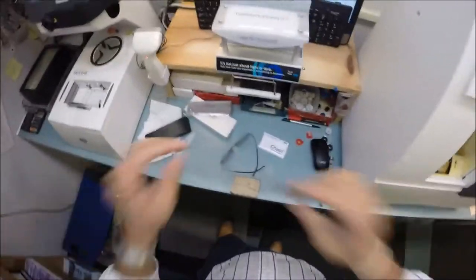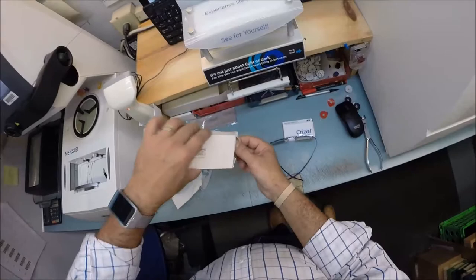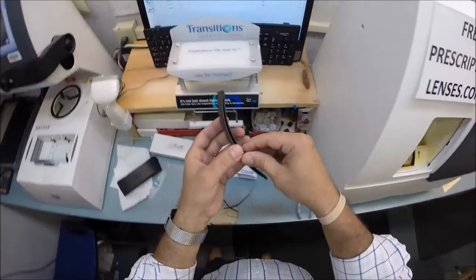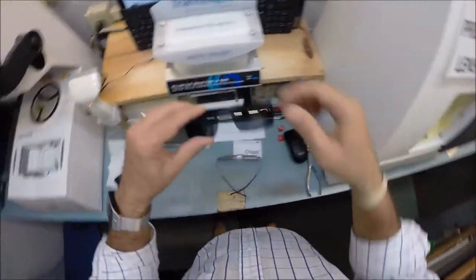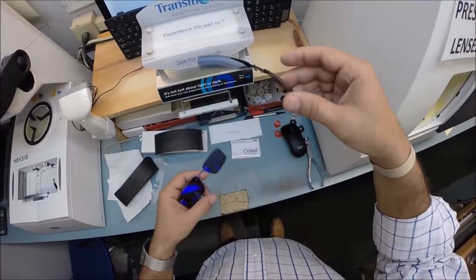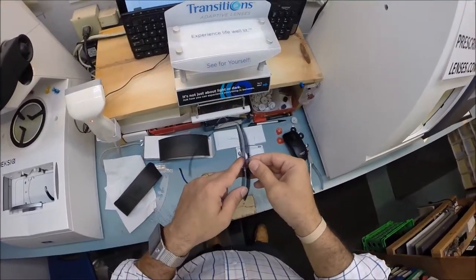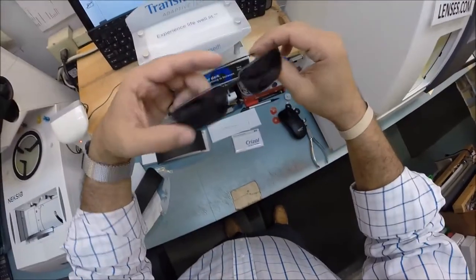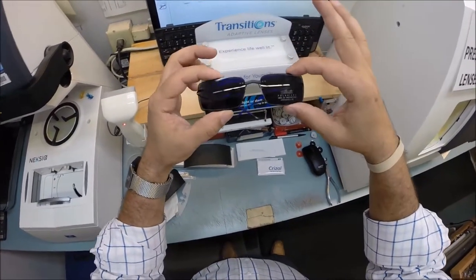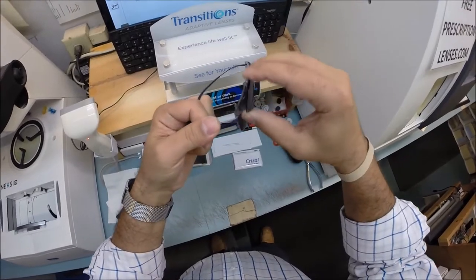One other nice thing about Silhouettes is because the Transitions lenses do not turn dark in the car, the frame comes with a nice curved sleeve that fits in your back pocket. This snaps onto the bridge — so these clip-ons, following the lightweight theme, are extremely lightweight and polarized. It snaps on and it's now the shape of my lens. Some people like to go a little bit larger — you can actually get a larger clip because it just blocks that much more sun while you're wearing them. To remove it, I simply rotate it until it pops off.